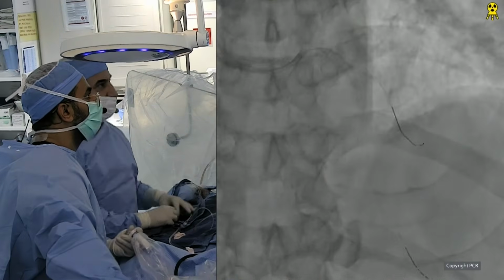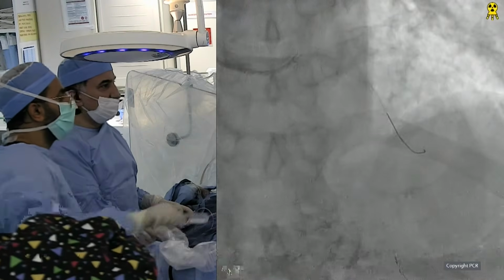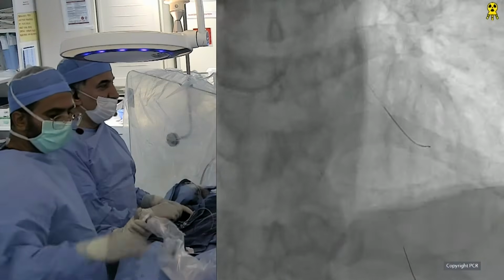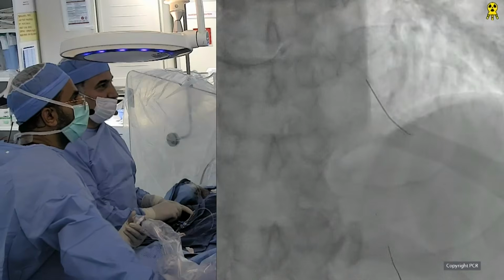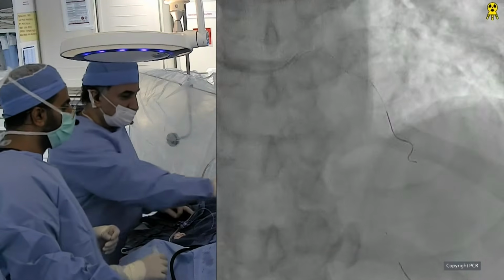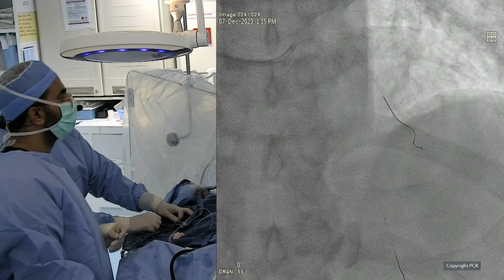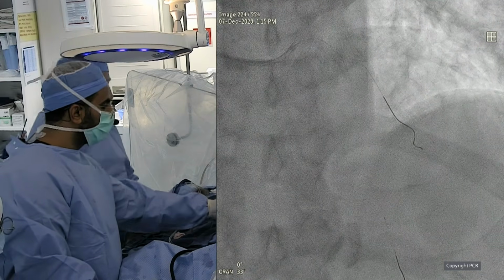Go. Okay, tell us where you are and what the next steps will be. This looks already like a very promising result in the diagonal. The ostium is well open. I think it will be very complex if I go up front with 2 stents. I will go with provisional, and as we can always deploy a second stent if the result is suboptimal.